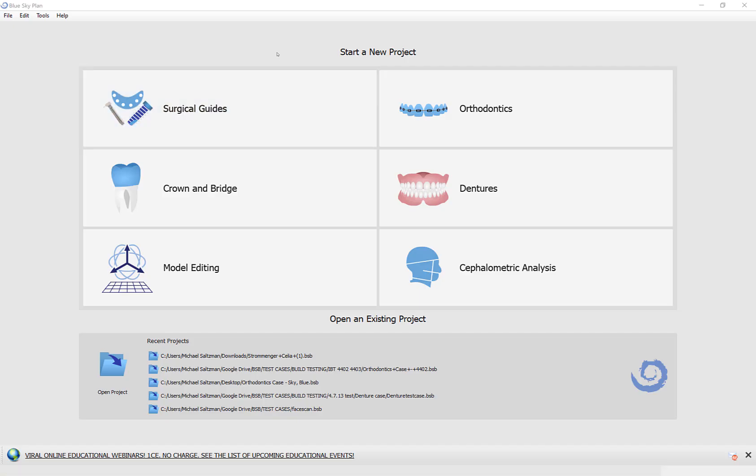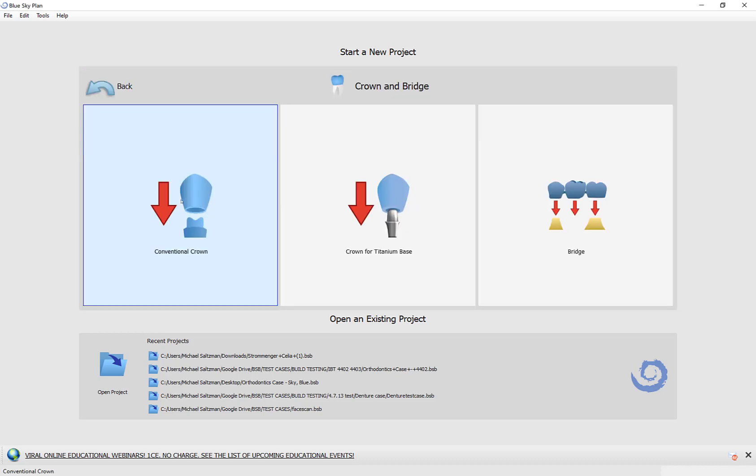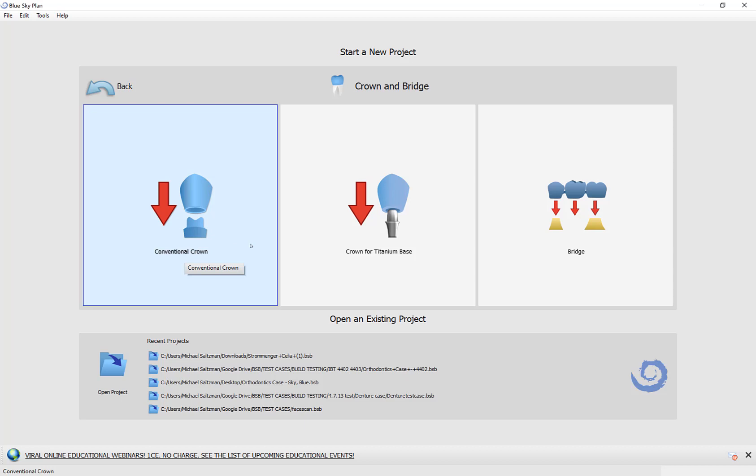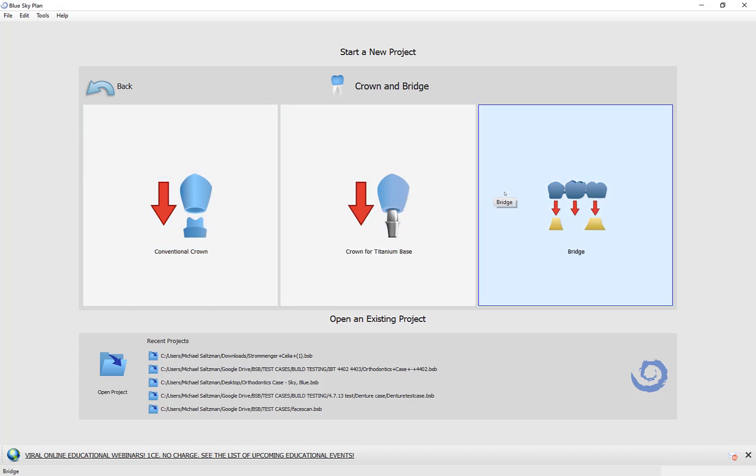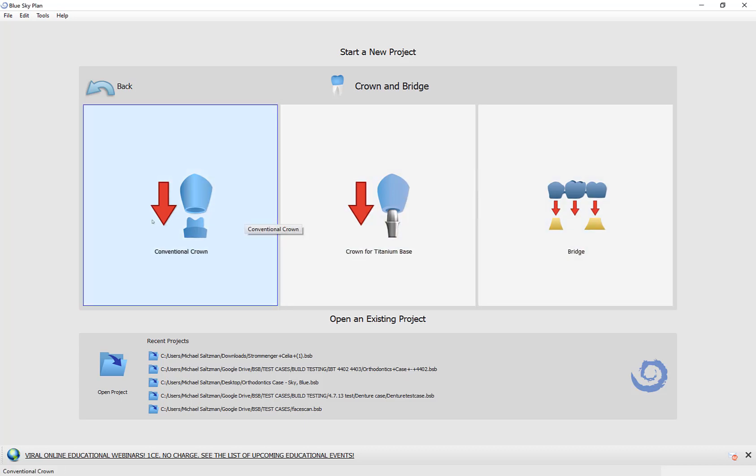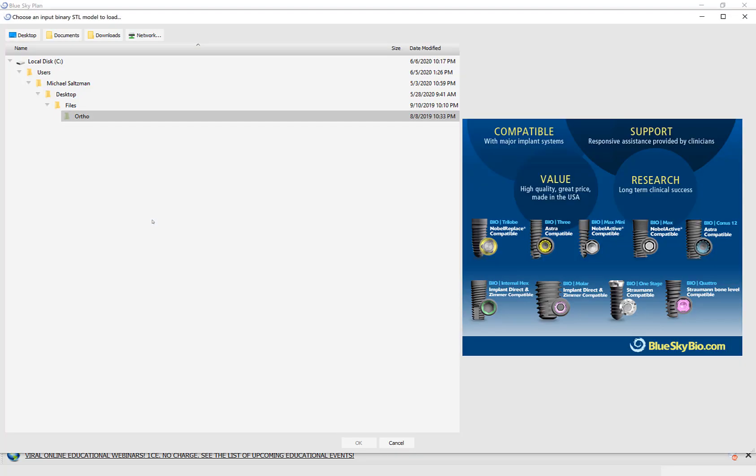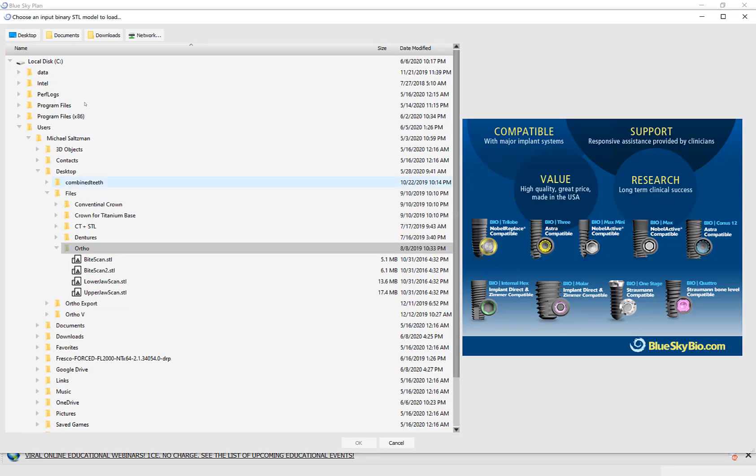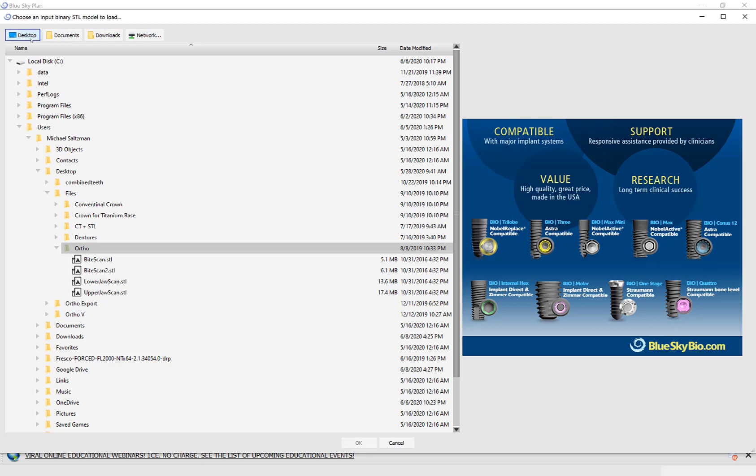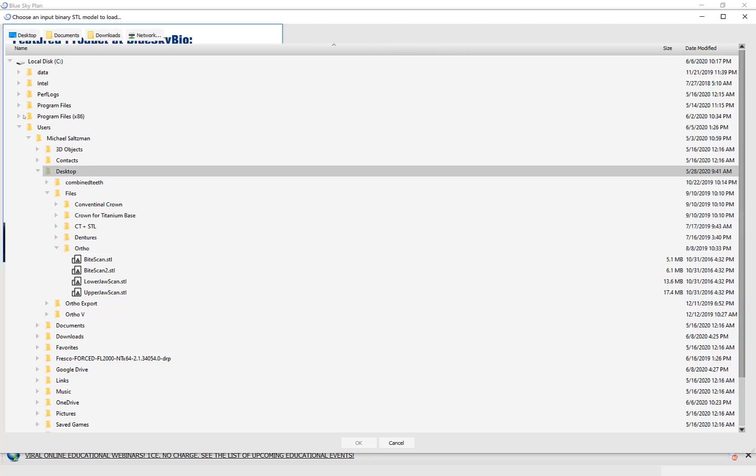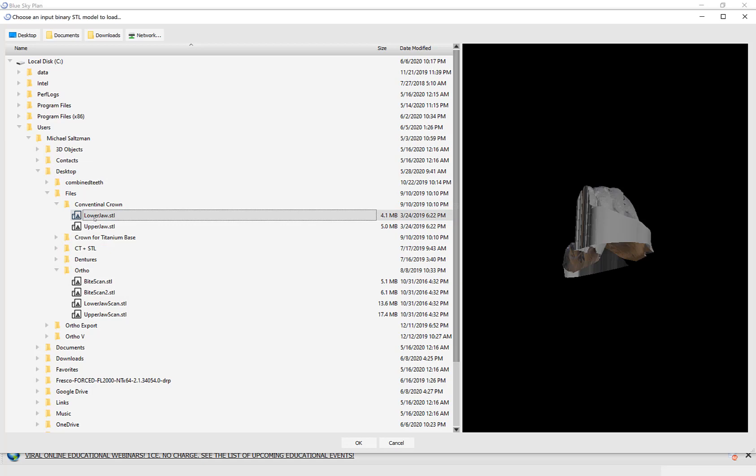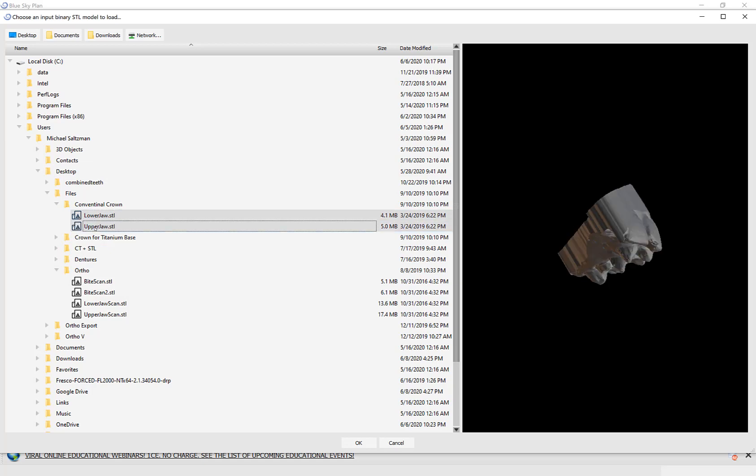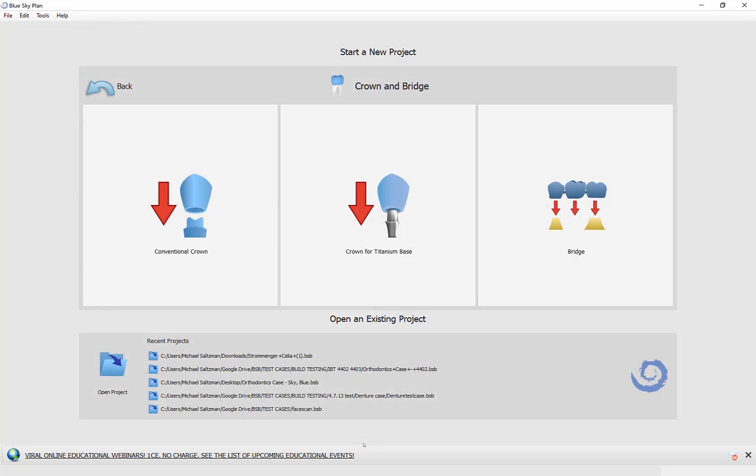To get started designing a conventional crown, simply click on crown and bridge, select the option for conventional crown, and yes, we have options here for titanium-based crown as well as designing a bridge. The software will automatically prompt you to load the relevant data sets. There are shortcut buttons on the top to access the desktop, documents, downloads, and your network. I'm going to click desktop, select the data set that I have for the conventional crown, and I'm going to multi-select by left-clicking on one jaw, holding down the shift key, and then left-clicking on the second jaw. Clicking the OK button will load the models into the software.